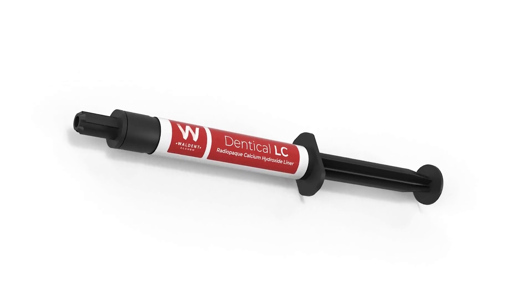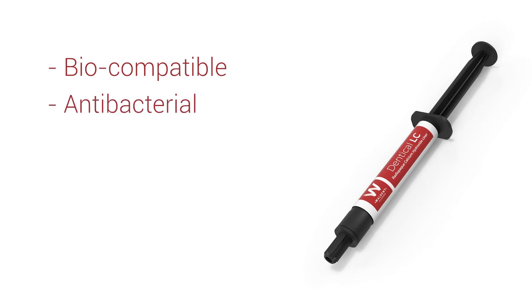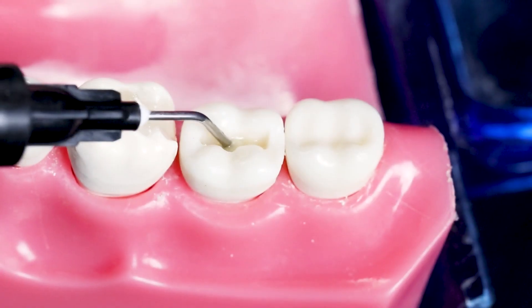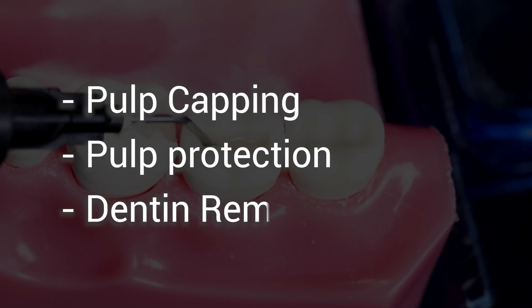Walden Denticle LC is a light cure calcium hydroxide based liner that is biocompatible in nature and has antibacterial, alkaline, and radiopaque properties. It serves as an effective liner or base for various restorative procedures such as pulp capping, pulp protection, and dentine remineralization.